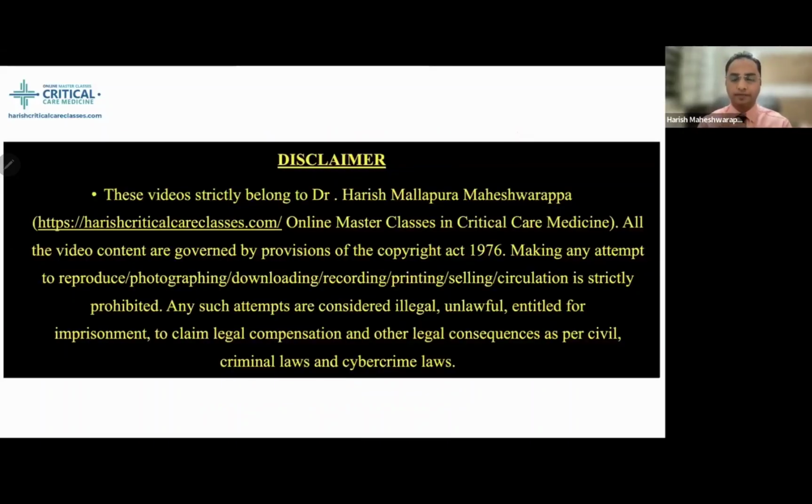In the recent era, we started using transcranial Doppler in the intensive care unit, particularly for subarachnoid bleed patients, to identify cerebral vasospasm and to initiate appropriate vasospasm preventive measures, or to schedule an angio when we have some suspicion.